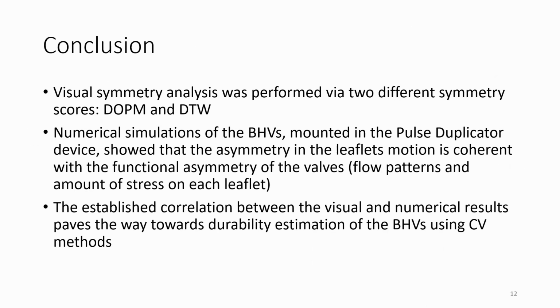To summarize, visual symmetry analysis was performed via 2 different symmetry scores, DOPM and DTW. Numerical simulation of the BHVs showed that the asymmetry in leaflet motion, as given by the DTW score, is coherent with the functional asymmetry of the valve, based on the flow patterns and the amount of stress on each leaflet. The established correlation between the visual and numerical results paves the way towards durability estimation of the BHVs using CV methods. Thank you.